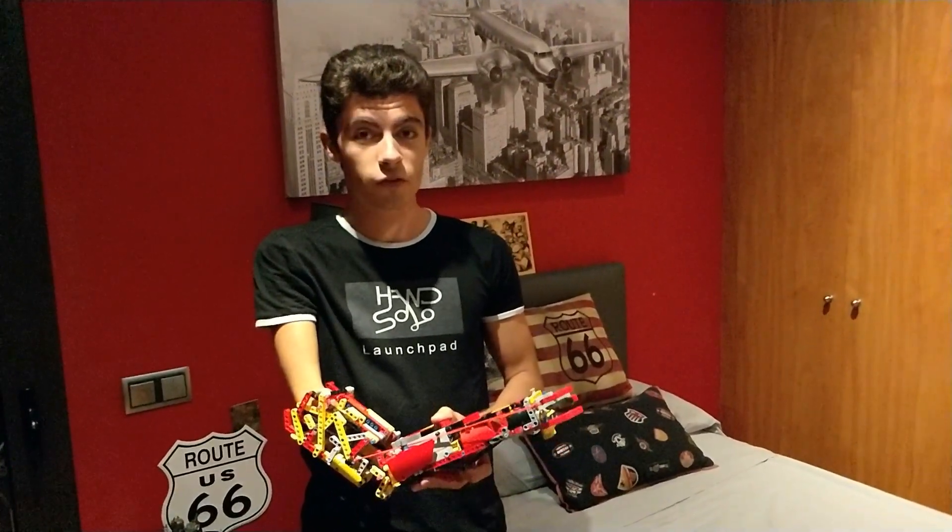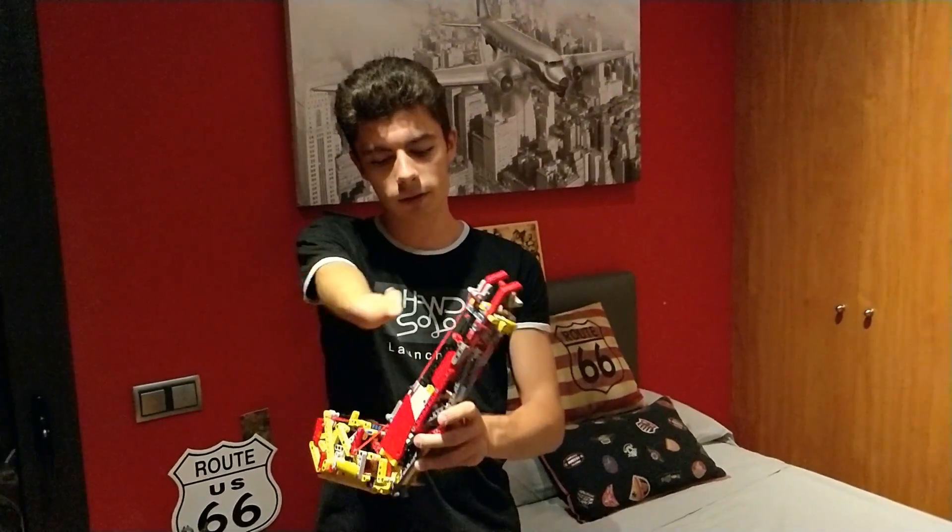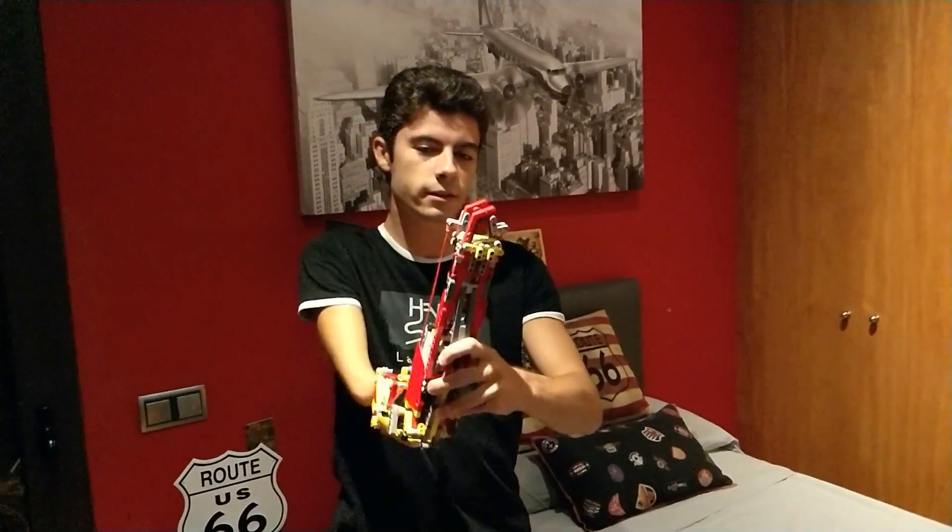If you remember, on my first video, I showed you how this works. Some cables, some movement, and the hand opens.